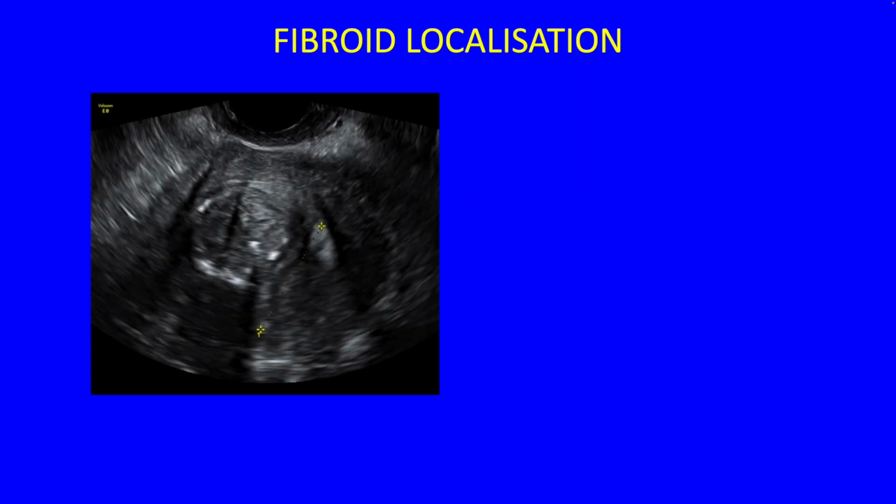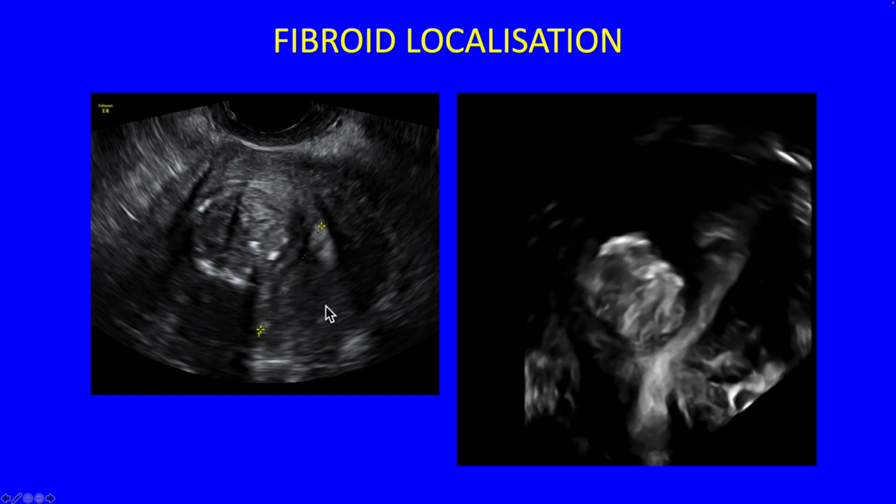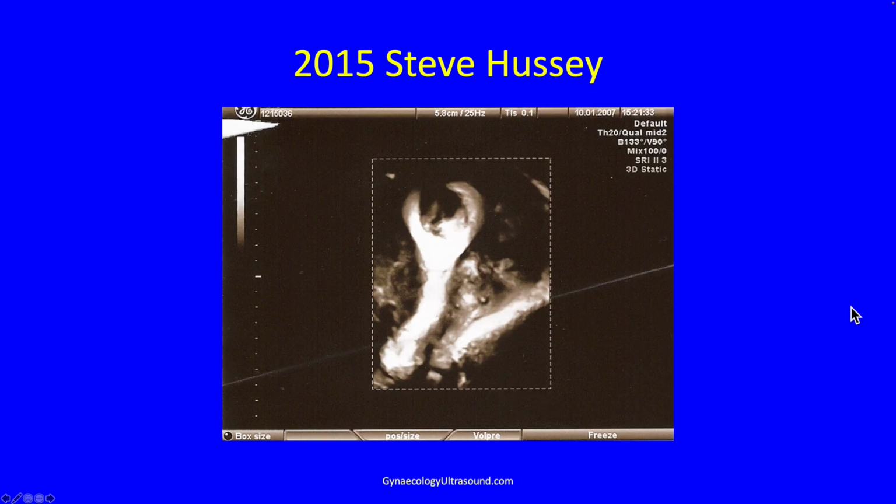Fibroids in 3D, not a big fan, because quite often fibroids absorb all the sound and the images on 3D are terrible, but I usually try, ever the optimist. And here you can see a fibroid, and you can see in 2D the endometrial cavity is close, and on the 3D it came up really nice that this fibroid is displacing the endometrial cavity toward one side. This would become more triangular if I just rotated on it a bit, but you can see that the cavity is being deviated and it is indeed in contact, so it's a submucosal G2 fibroid.